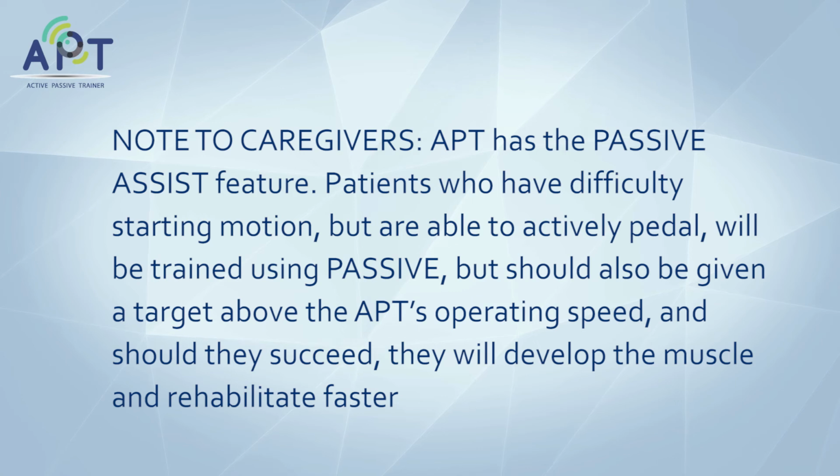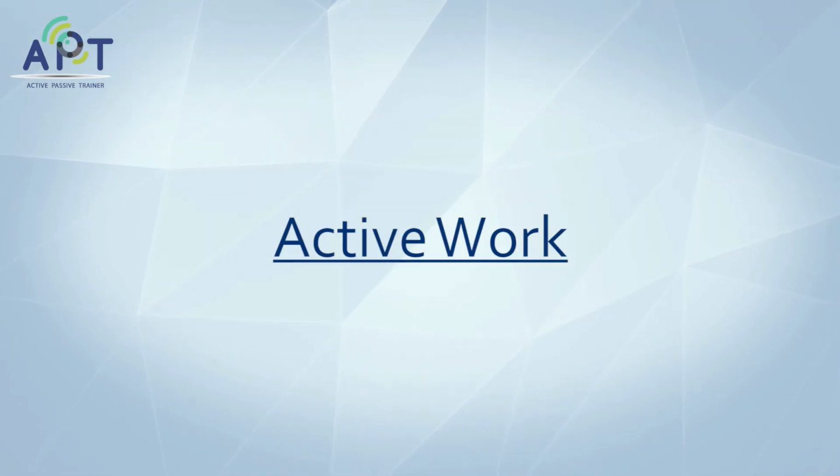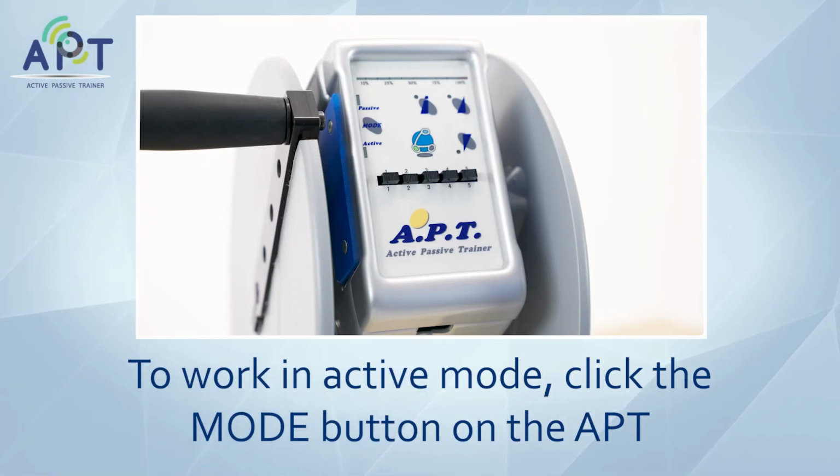Note to caregivers, A.P.T. has the Passive Assist feature. Patients who have difficulty starting motion but are able to actively pedal will be trained using Passive, but should also be given a target above the A.P.T.'s operating speed, and should they succeed, they will develop the muscle and rehabilitate faster. Active work. To work in active mode, click the Mode button on the A.P.T.